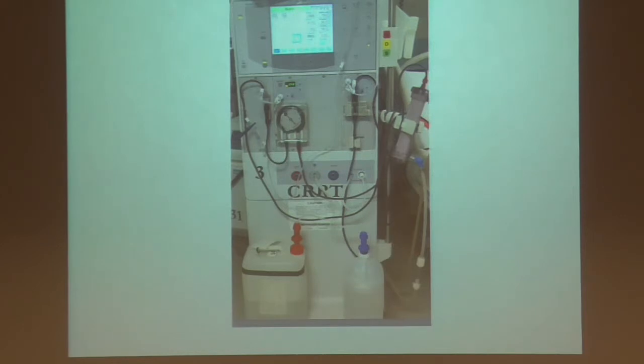I can't even say the acronym anymore, but it's continuous arterial venous hemofiltration or hemodialysis. So what was the difference between CVV and CAV? Well, we just have one line, right? So it's all veno-venous. Back in the day, they would have an arterial line and a venous line in every patient. So obviously that's where you always hear those risks, and you see on those consent forms, air embolisms and everything were very common. Every time for dialysis, you couldn't just leave the line in. You had to stick in an arterial line every time, and a venous line every time, take them out after the dialysis, and then stick them back in. So that's where you hear the complications come from. It still happened, but much, much less.